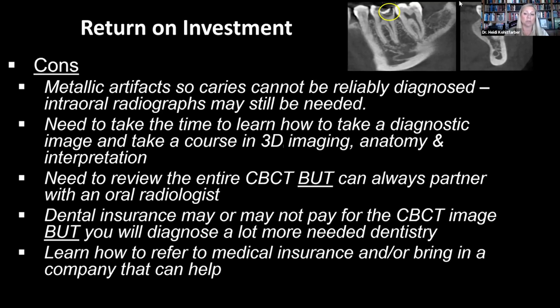You do need to take the time to learn how to take a diagnostic image. You should probably take a 3D course, learn about anatomy and your interpretation. But anatomy and interpretation, it's just fun. So I don't see that as a downside, but I put that in there. Need to review the entire CBCT. It can take time. You can always partner with an oral maxillofacial radiologist.